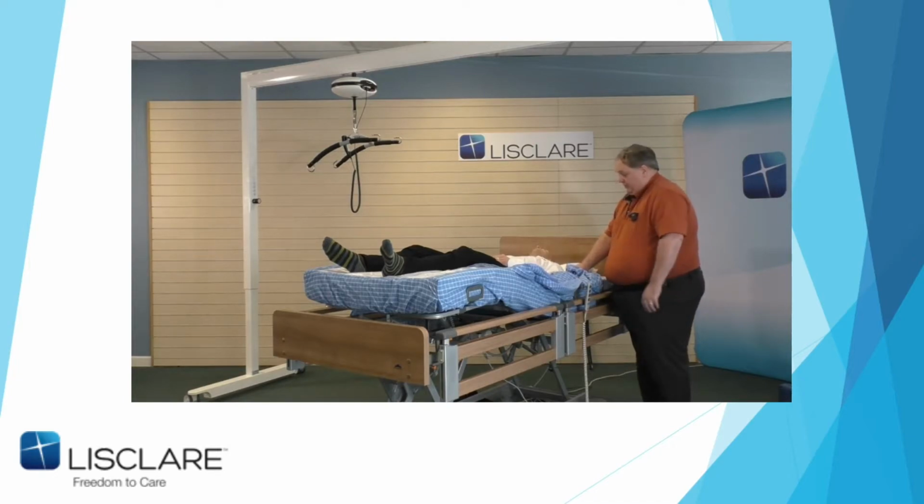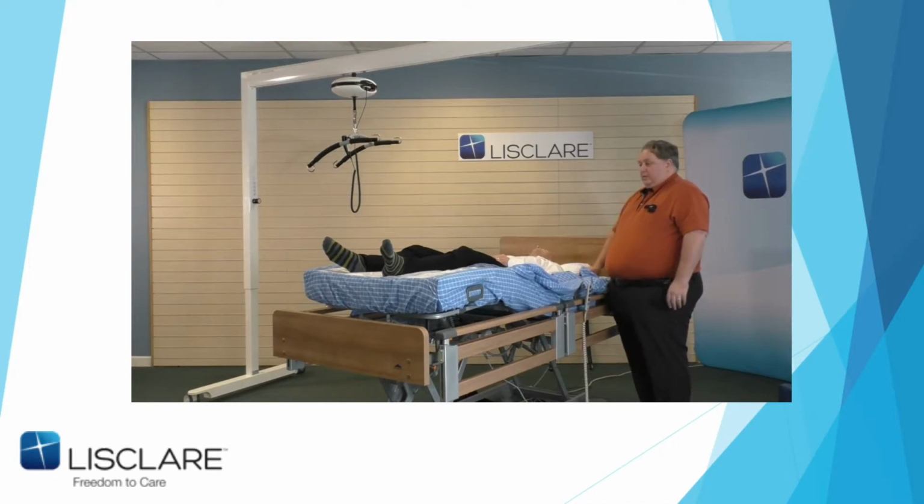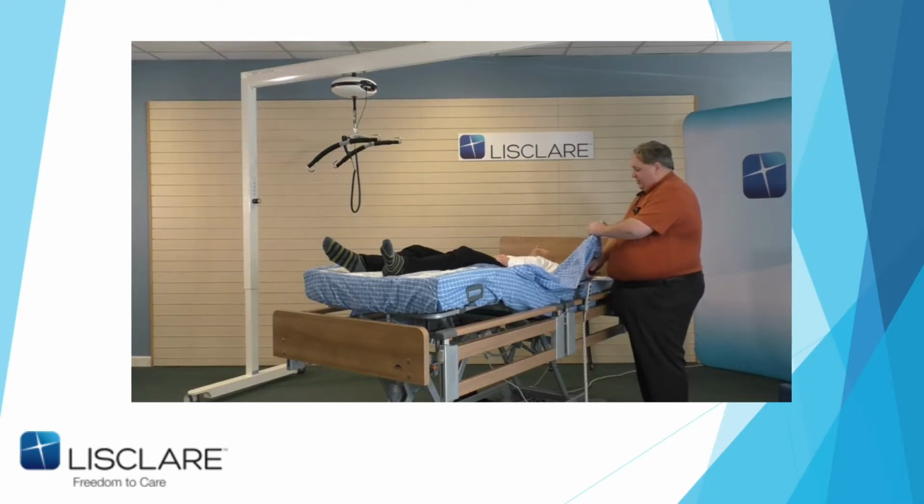Now, my access point I want to be is here, so that I can grab the sheet at John's shoulders. And I'm going to show you a wee cheat, and this is a wee shout out to Irv, who I didn't put in the presentation. Irvin Sahota is from London. He was a physio. He was one of the martial art experts, basically Hogan's long lost son, as far as I was concerned.